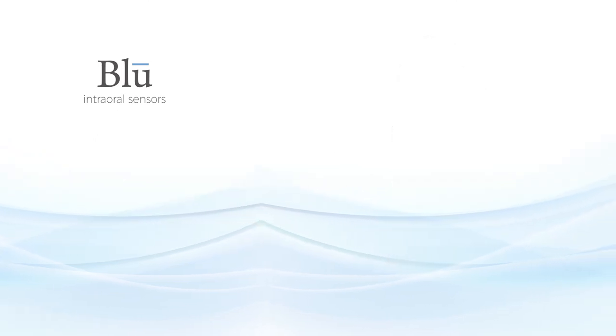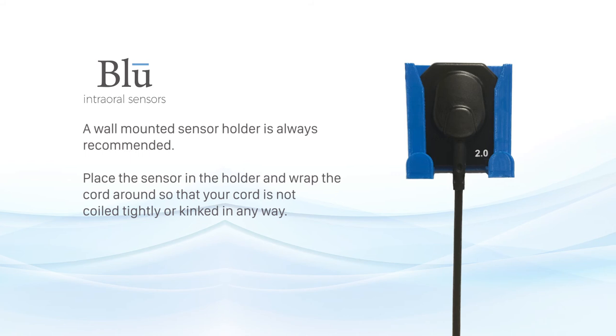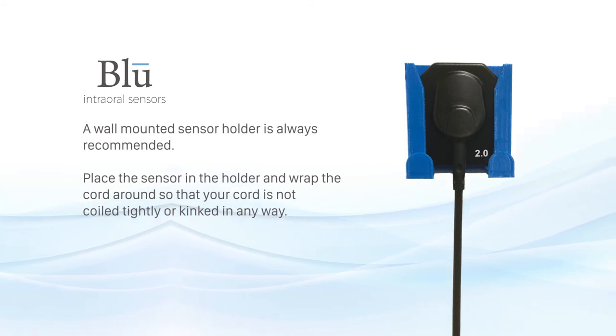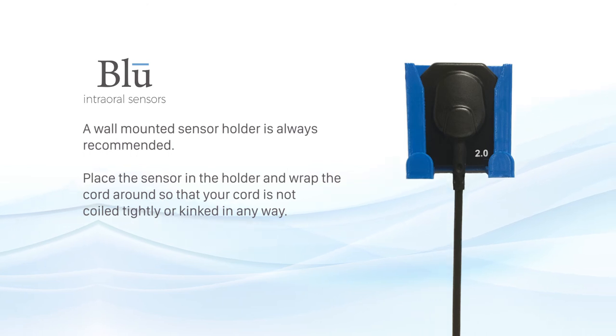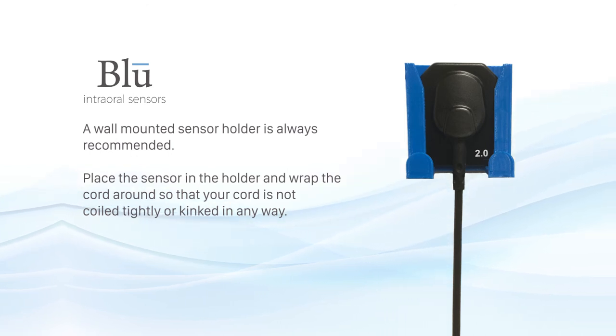Storing the sensor. A wall mounted sensor holder is always recommended. Place the sensor in the holder and wrap the cord around so that your cord is not coiled tightly or kinked in any way.